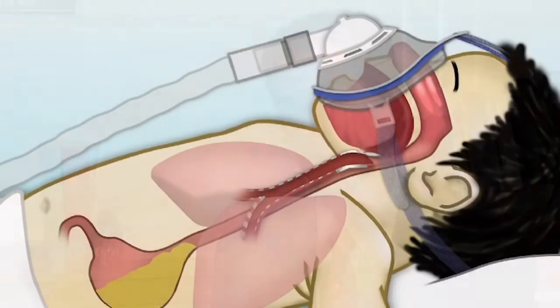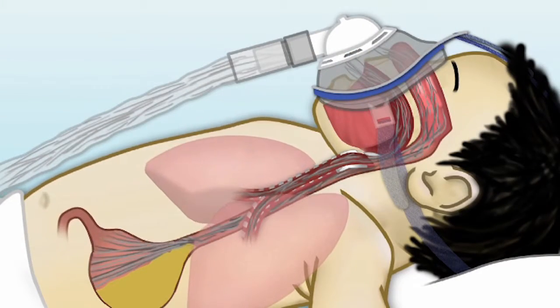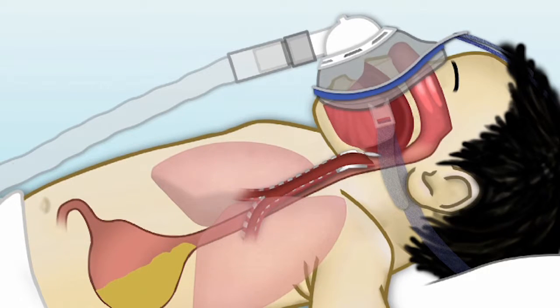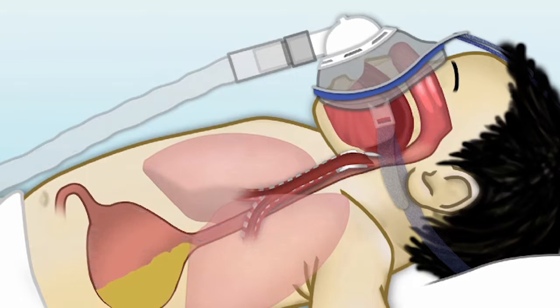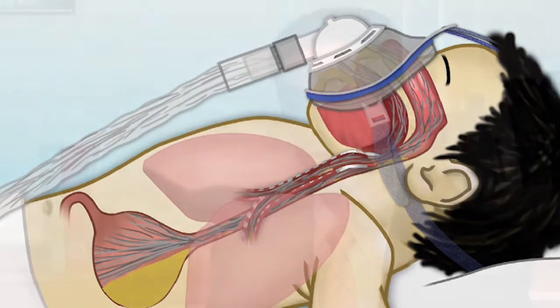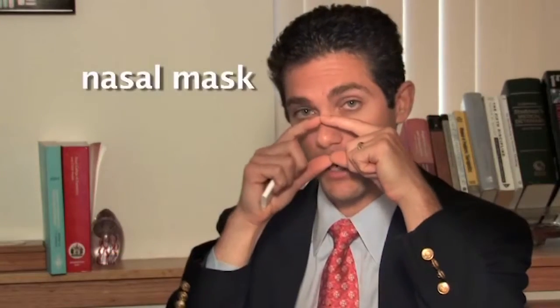Aspiration risk we've talked about. Full face masks, either the circumferential face or the nasal oral face mask, do place patients at risk for aspiration if they vomit into the mask. It is because of this in some of the smaller patients that we usually recommend just a nasal mask. If someone is too weak to pull a mask off, or too weak to alert a provider that they vomited, nasal masks are a nice alternative.